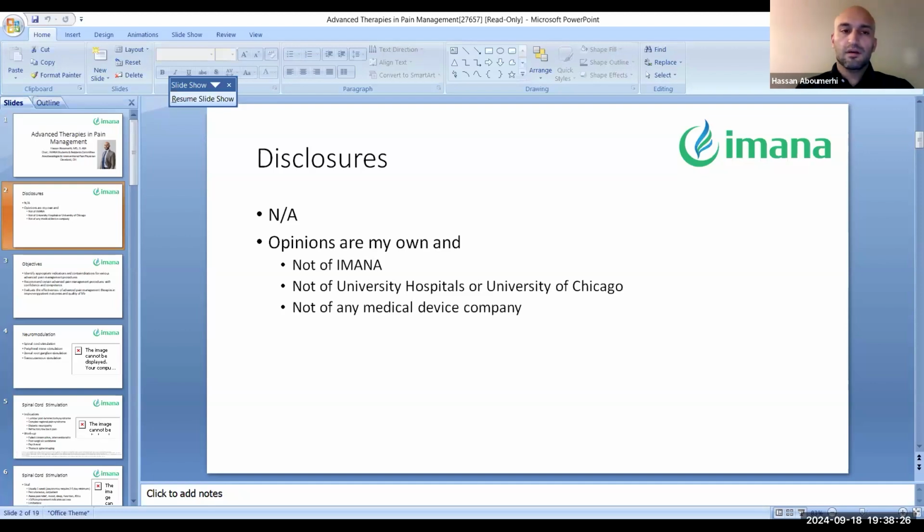The implant itself requires two incisions, one at the midline of the spine where the epidural leads are actually placed. And then there's another incision, usually made at the flank or the buttock, where the implanted pulse generator, the battery, is actually going to go. And then the leads are tunneled underneath the skin to that battery. There's a lot of different nuance here with perioperative practices when it comes to prep and post-op follow-up, but most will usually give some prophylactic antibiotics here to help prevent infection, and then those movement restrictions are recommended for 6 weeks post-op.